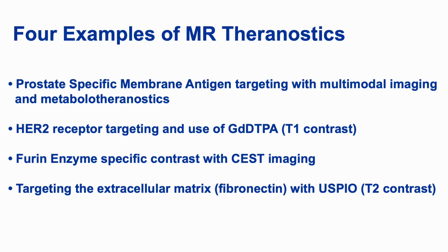The second example is of HER2 receptor targeting. So HER2 is expressed by breast cancer cells. And this is a pre-targeting strategy that uses Gd-DTPA to generate T1 contrast.